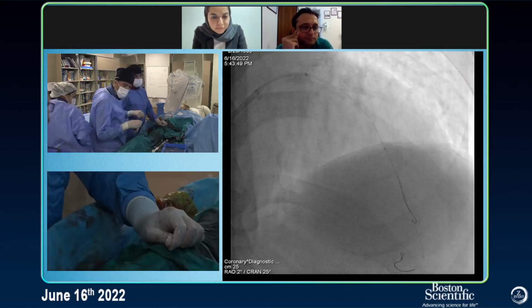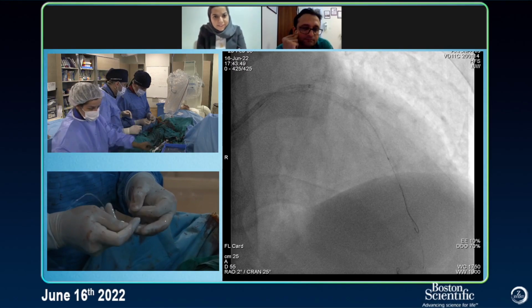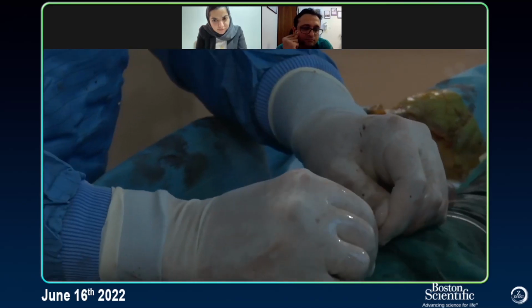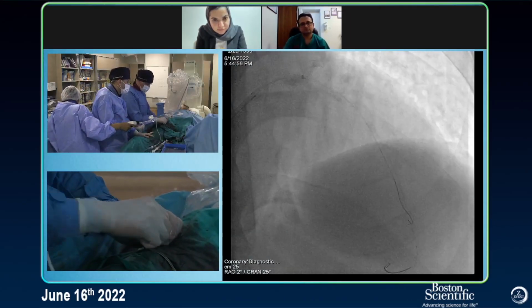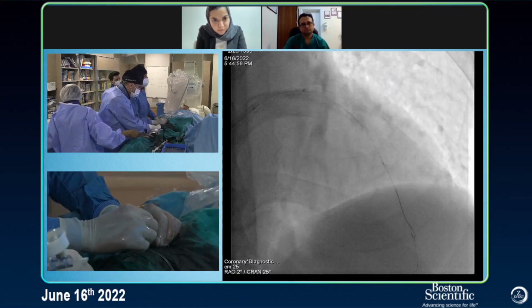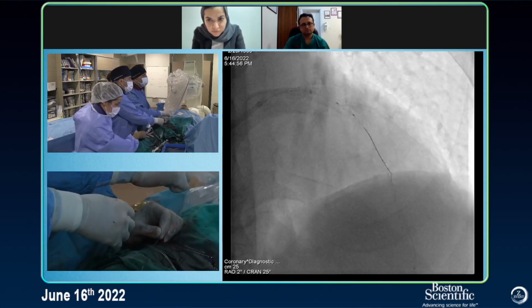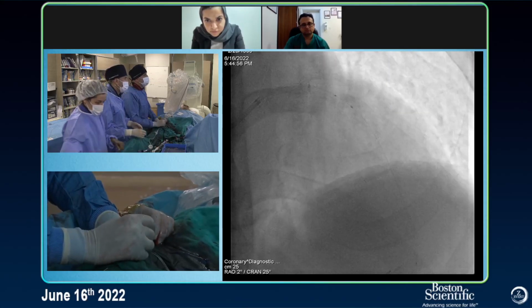2-0 balloon. Then 3-0? Yes. Let's do 3.5 and 3-0, we did the distal. 2.75. Alright. Normally I do double kissing balloon, but here I don't, you know. I don't want to make this wire more complex. Yes. I remove the jail one. I can send another wire. 12-14.